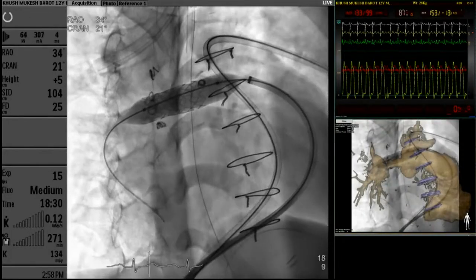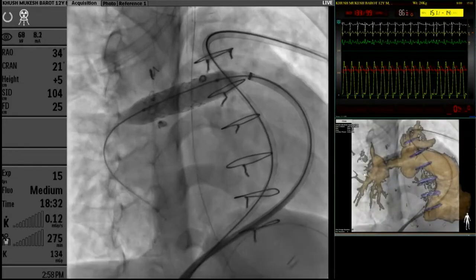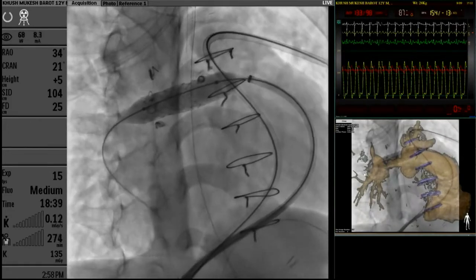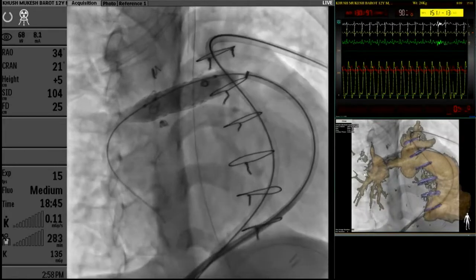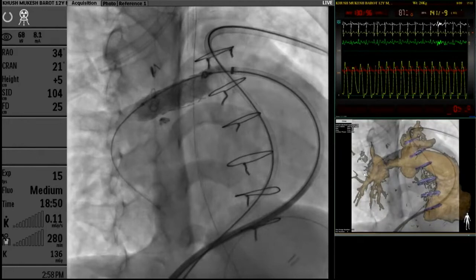That's it. Okay, now is it 11? Yes, sir. Go to 11 and stay at 11. 11 is the burst pressure of this Admiral Xtreme balloon. So I'm going to 11. Okay, you can see that the distal end is slightly narrow, which is the more critical part. Deflate now fully, sister. And as it is getting deflated, I'm slightly pushing the sheath.